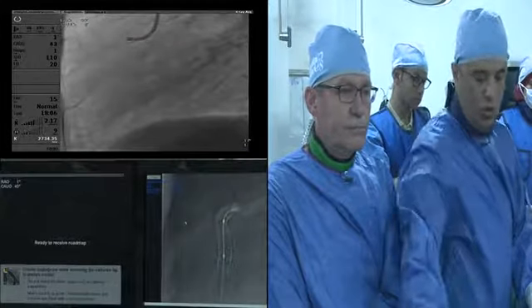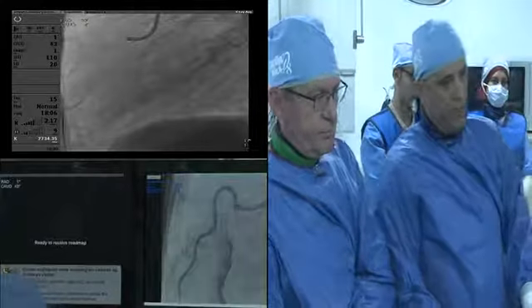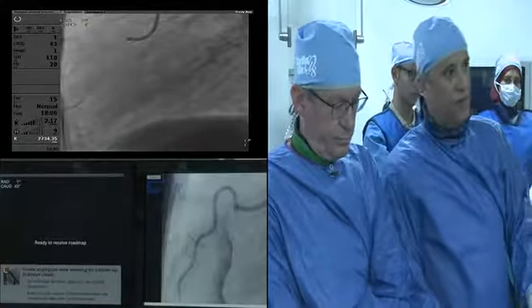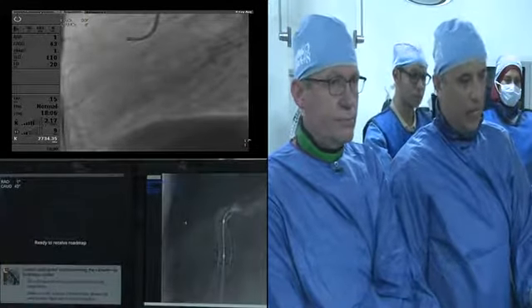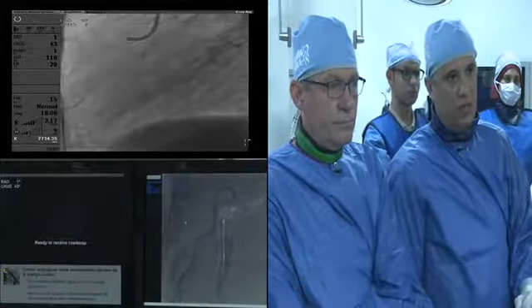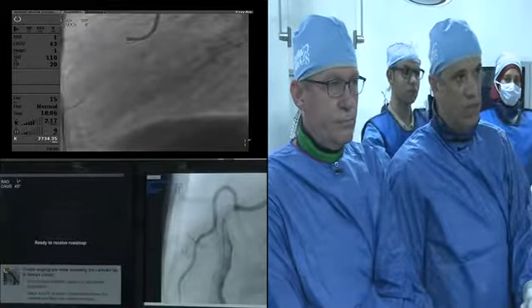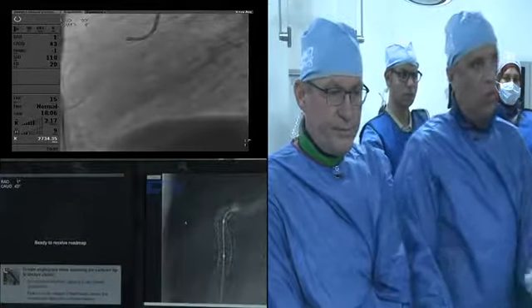Okay, so Dr. Sobhi, for the sake of time, we have to move because we have lost 30 minutes from the live right now. You are facing a multi-vessel disease, and as we can hear, some favor starting with this LAD first, and other people favor doing PCI for the RCA first. So I will let Dr. Peter show you what we did.